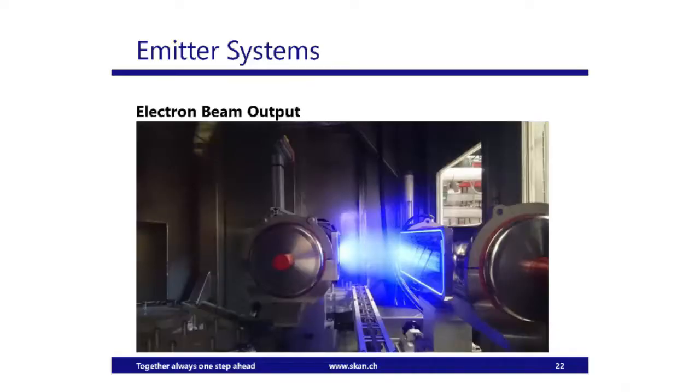This is when they work. These are the electrons. They come out here, out of the foil, and they are glowing, fluorescing in the air.